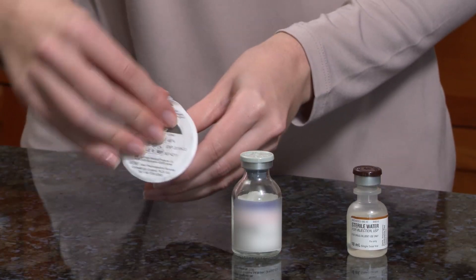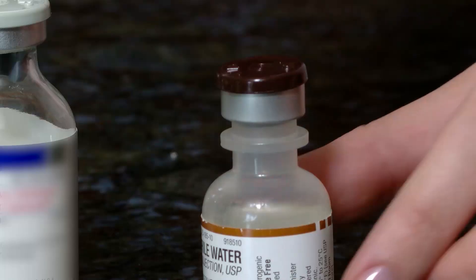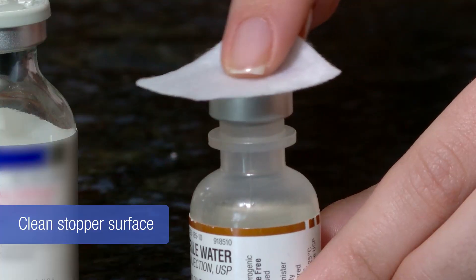Open the mix-to-vial packaging by peeling away the lid and leave the device inside the packaging. Next, remove the flip-off cap from the water vial and clean the stopper surface with an alcohol swab.